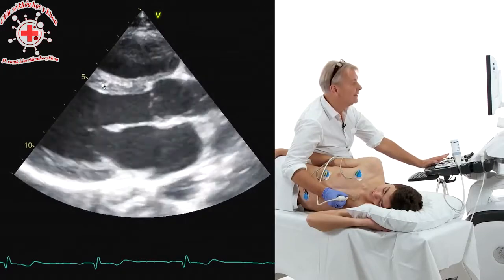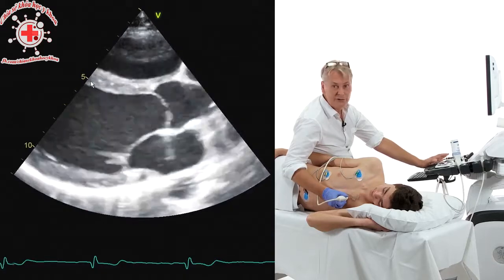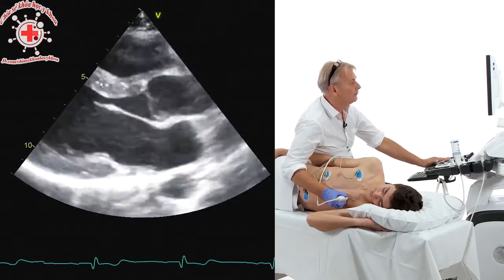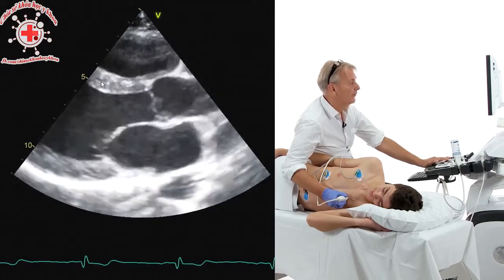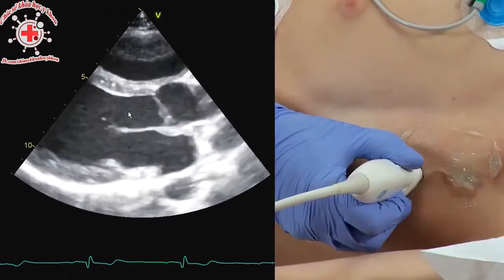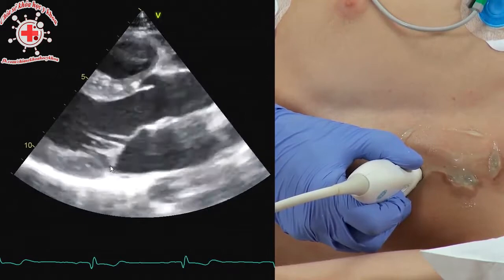Now, this is not a diseased left ventricle, it's a normal ventricle. But with the high resolution we have in the modern machines, we can even see the orthogonal cut of the myocardial fibers. So don't mistake this for some kind of a pathology. We have the mitral valve here with the anterior leaflet and the posterior leaflet.